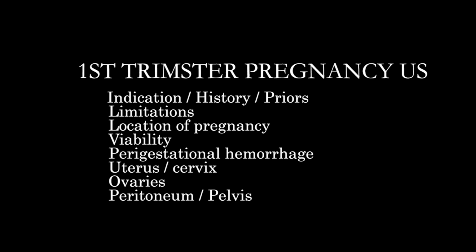Okay, so big picture, how do we take a look at this exam? What is the overall structure of our approach? So it's really important to understand what's going on with the patient. How far along is the pregnancy? Do we have a serum HCG? Is there any history of fertility treatments, prior interventions? Have they been imaged before during this pregnancy? Things like that. What is laterality, location of patient's pain, if any, or other symptoms? Those sorts of things can be helpful.